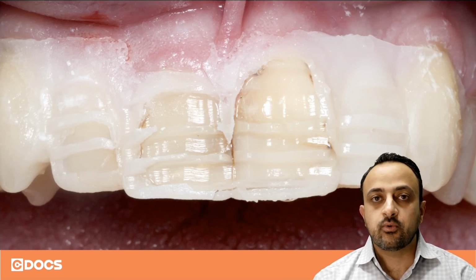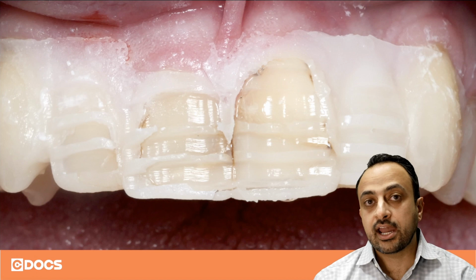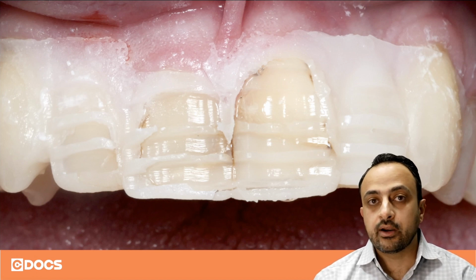So just an easy way to get information into the patient's mouth to guide you in your preparations so that you're only preparing the areas that are needed.